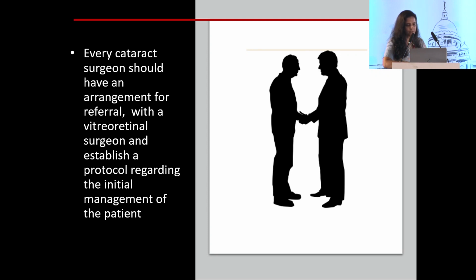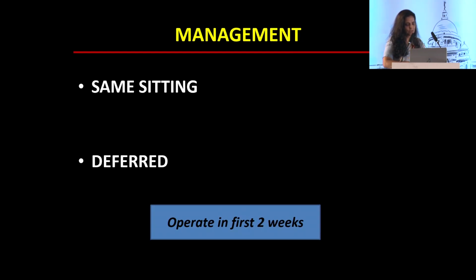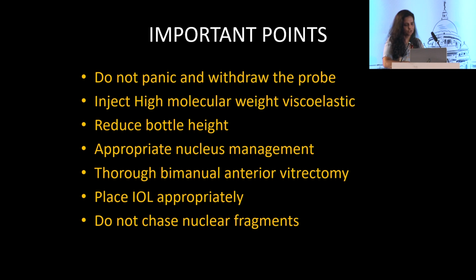Always have an arrangement for referral with a vitreoretinal colleague and establish the protocols for the initial management of the patient. The management of a drop nucleus can be done in the same sitting or it can be deferred. It's okay to operate within the first 2 weeks.